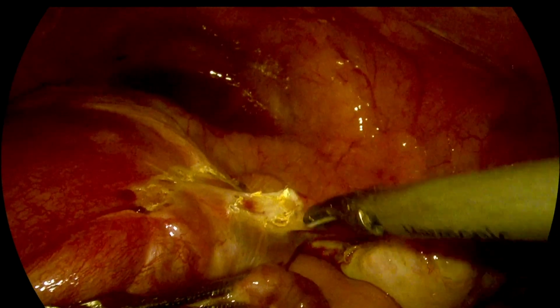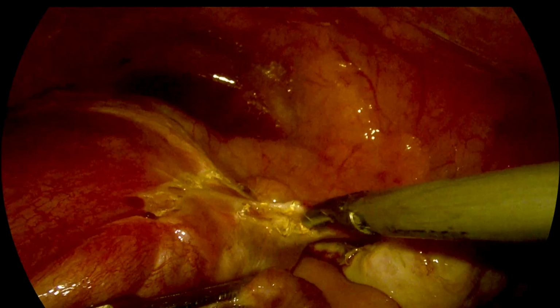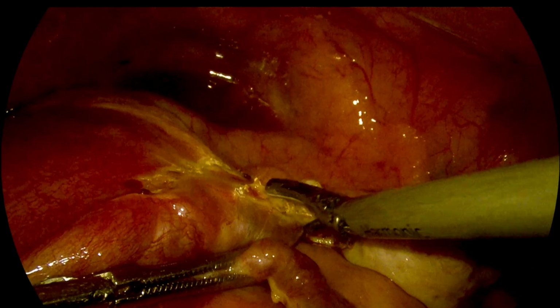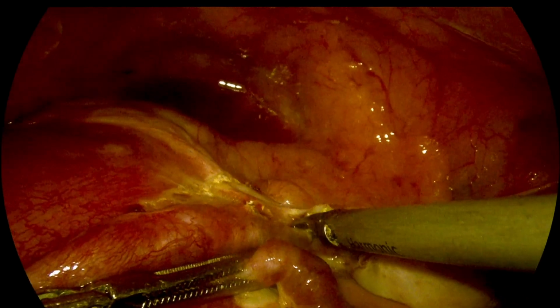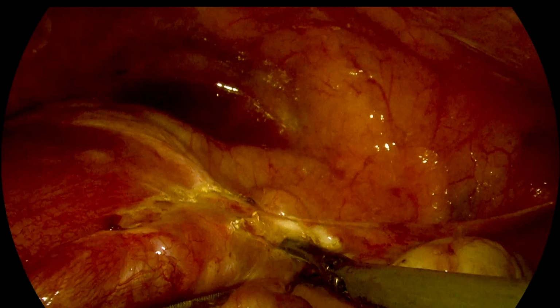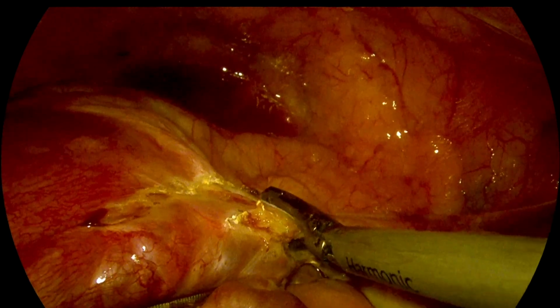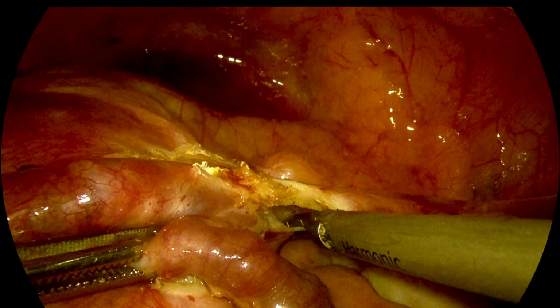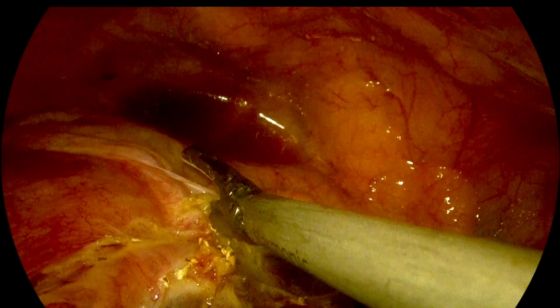So even on the right side, we are trying to identify the plane between the bladder and the anterior surface of the cervix. The round ligament is very much thinned out on the right side and separated, so it is not identified. So this is the posterior fold of peritoneum near the round ligament.